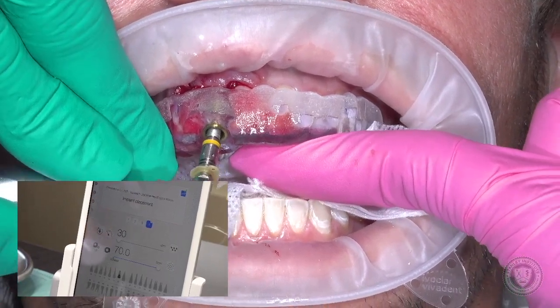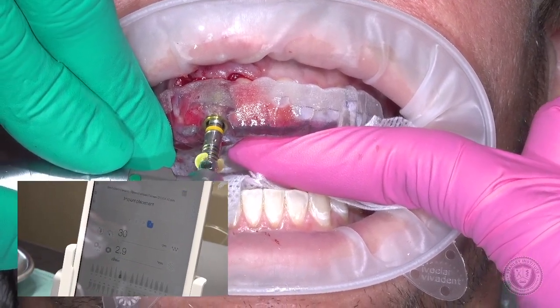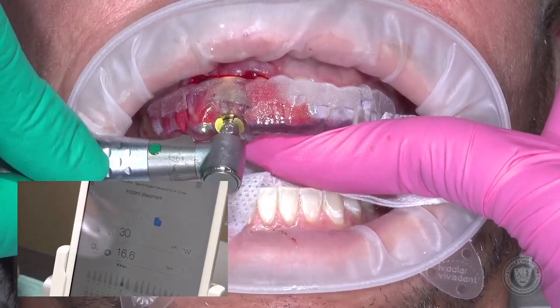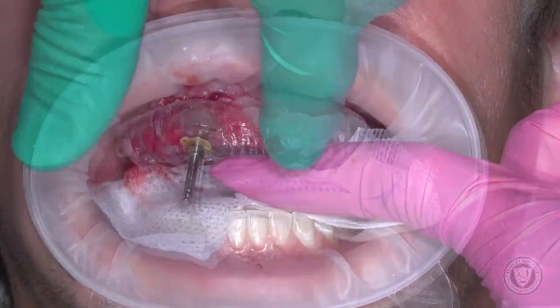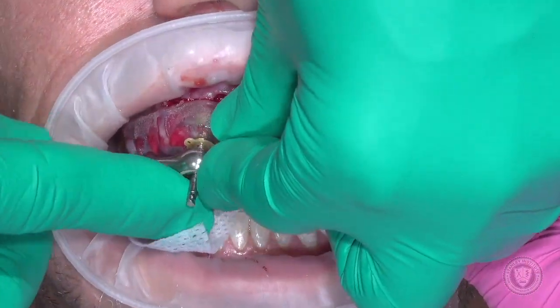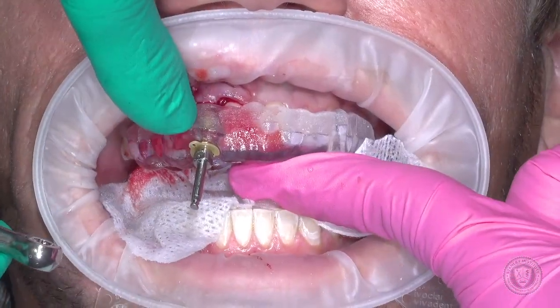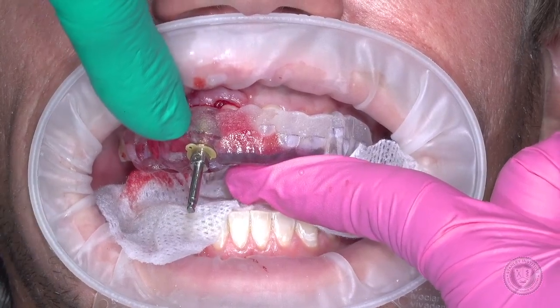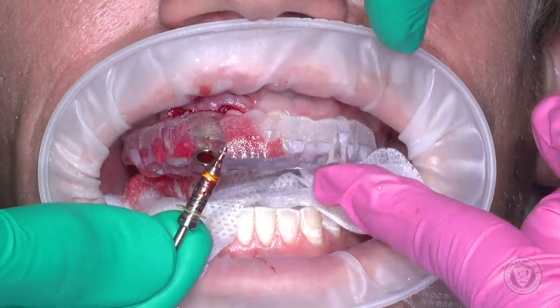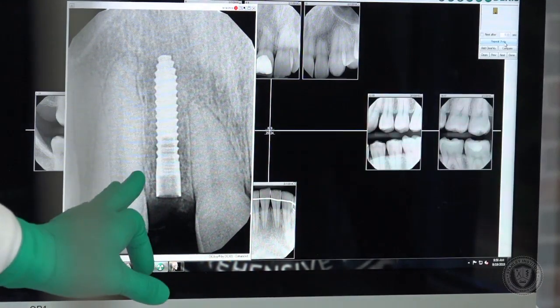You wiggle it until it gets seated, and then start to rotate until the guide catches. I can come in with a hand wrench and tweak the position. If I just want this to be just a smidgen more towards the facial, now I know I have a flat on my hex right to the facial. In cases where you might need an angled abutment, that would come in handy. This is our implant placement, and we couldn't be happier with that placement.